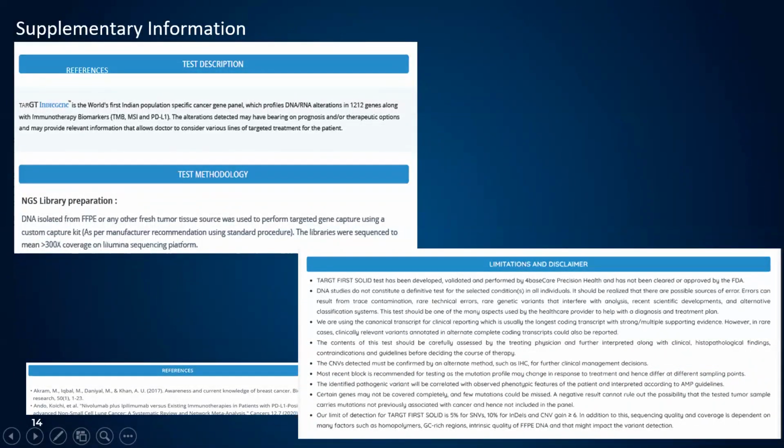Whereas in the amplicon chemistry, there are PCR duplicates, meaning it's not the true signal. The same signal gets repeatedly amplified, which is not going to give you the true picture. That is the reason why you have to collect more data in amplicon, where you will go beyond 1000x to see the actual results. And in every assay, it is becoming very important that you show the assay's quality parameters, that is, its limit of detection essentially.